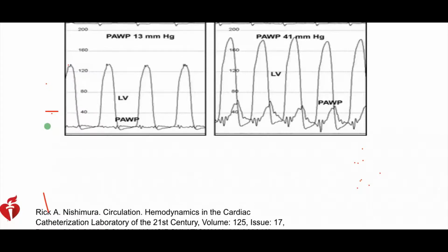Severe diastolic dysfunction. Thank you so much. Because there's no MS here. There is no MS, so the only explanation I would jump into is diastolic dysfunction. Well done. Now, what is this?